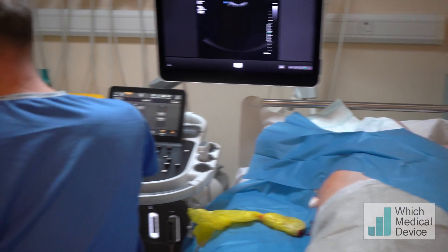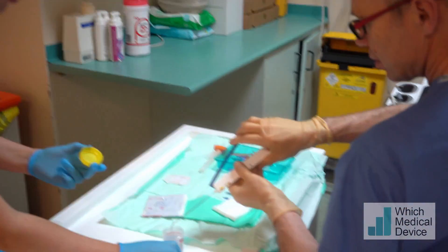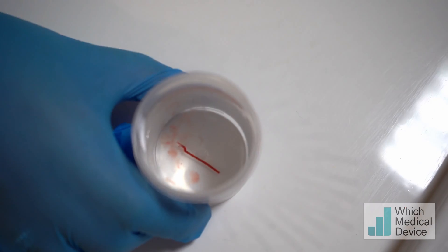Now if we can just have the pot please. And you can see the core there — a good tissue core sample obtained.